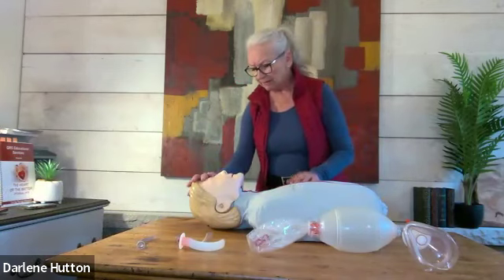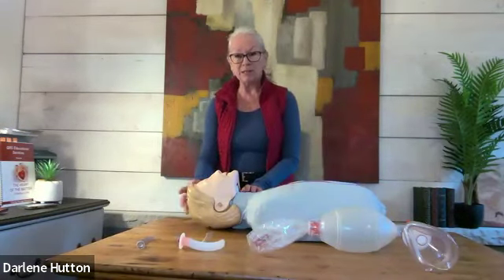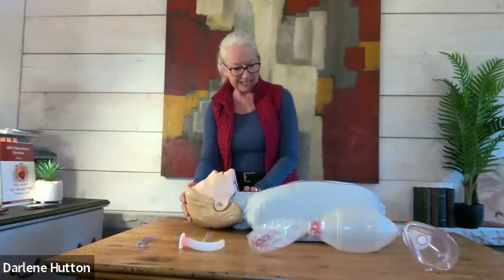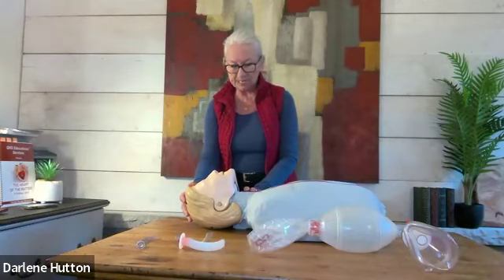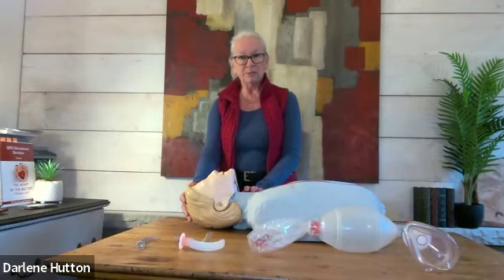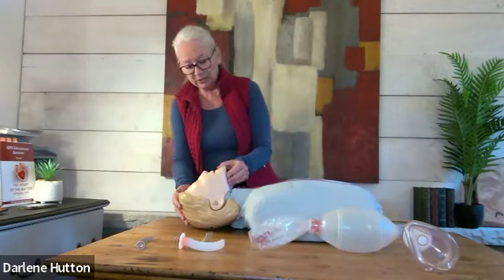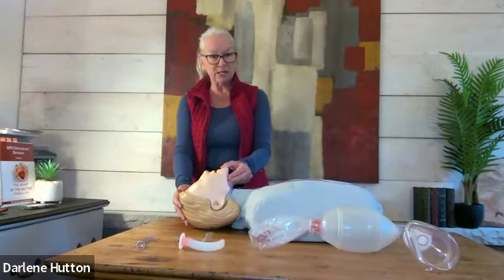Are they responsive? As I call for help, I will be assessing a pulse check. I will also be observing to find out if there are any attempts at breathing, agonal breathing, or no breathing at all. In this particular case, the patient does have a pulse, but I observe that there is no respiratory effort. So I'm going to do the head tilt chin lift. I'm going to look in their mouth to ensure I don't see any foreign bodies that may be obstructing the airway.